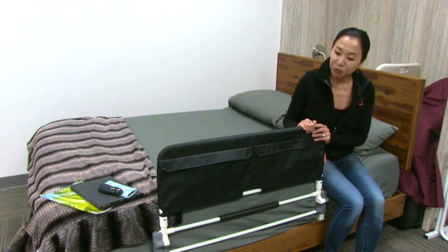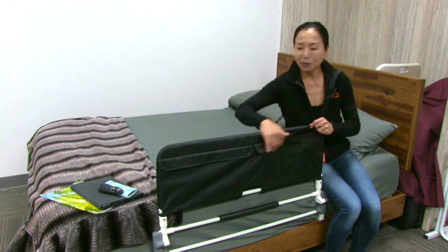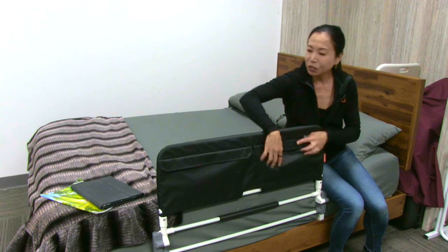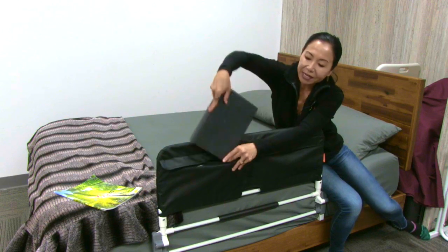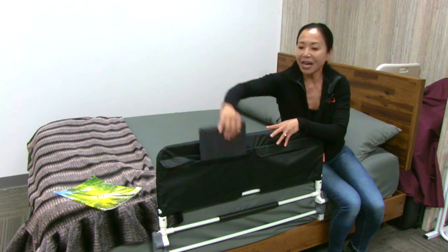The other feature that I really love are the organizer pouches. Here you can put so many personal belongings that you want to access. I've got just a couple of things here — reading glasses, a remote control, and you can even put an iPad or a magazine. These items very easily fit in these pockets so when you're in bed it's easy to access them.